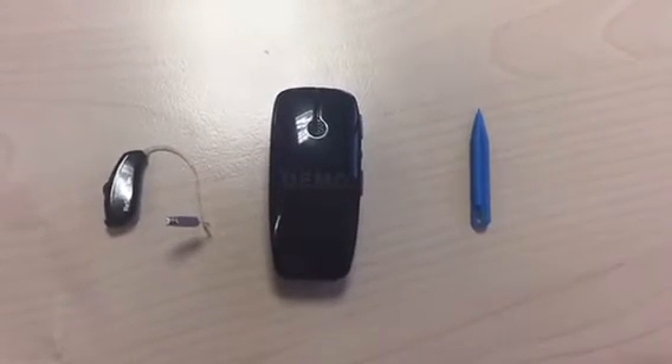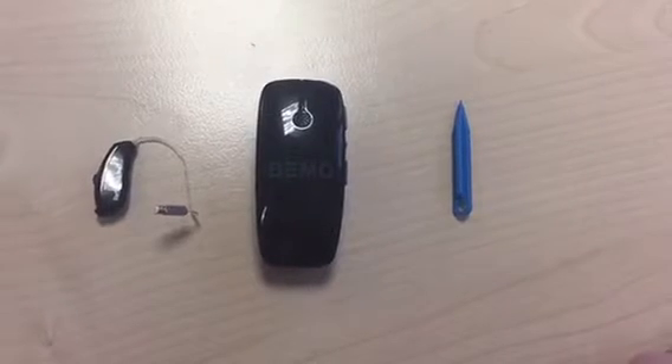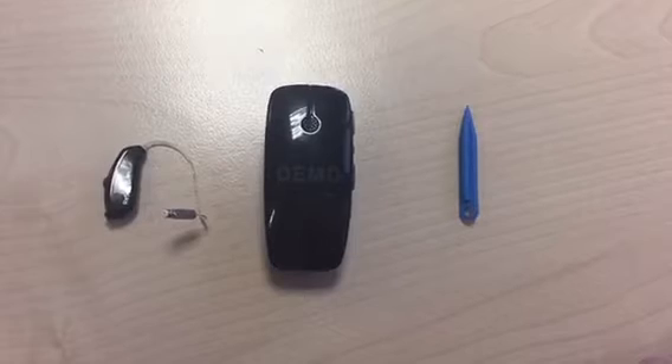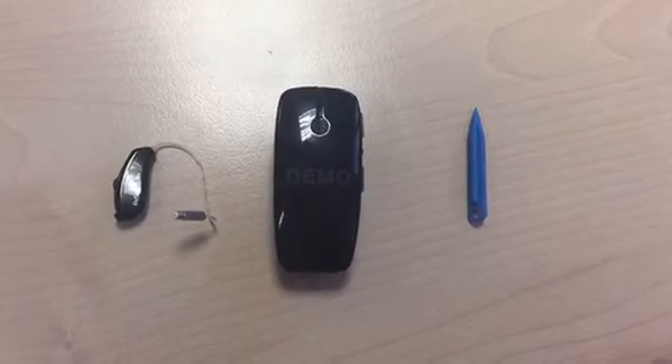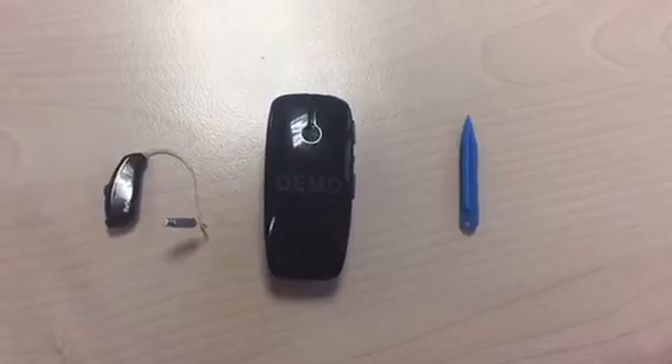In this video I will show you how to pair a Lynx hearing aid from ReSound to the multi mic. For this you will need your ReSound hearing aid, the multi mic, and a pointed object.